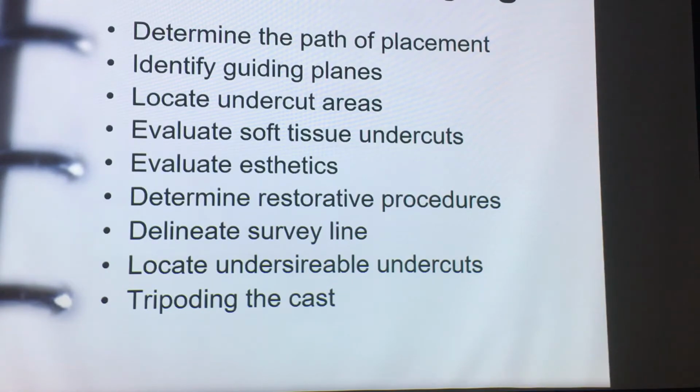Also in that booklet, there are step-by-step pictures of what I've done with Kennedy Class 1 mandibular surveying, but I'll also have a demonstration for that, either here on video or again in the classroom live.